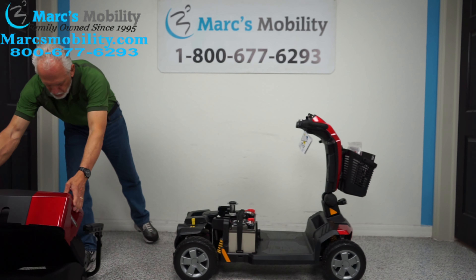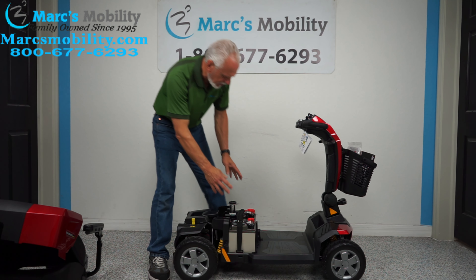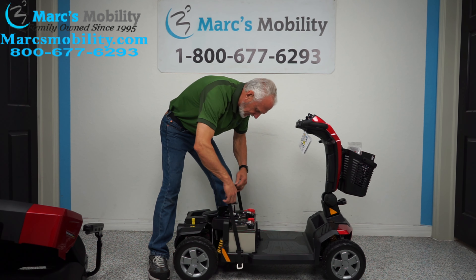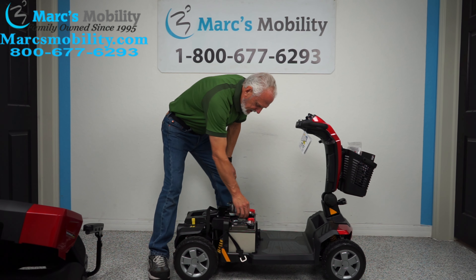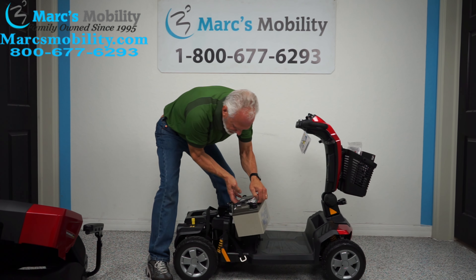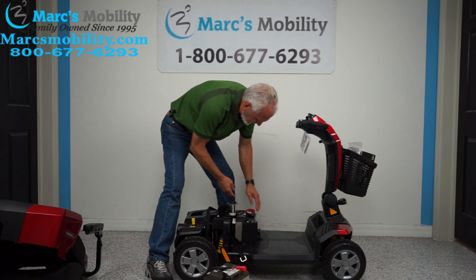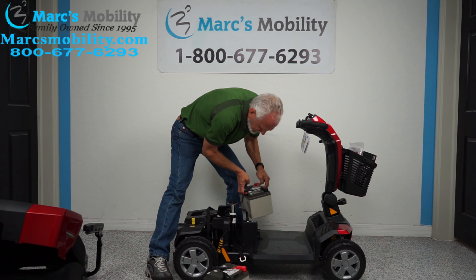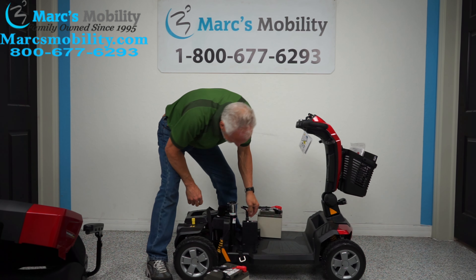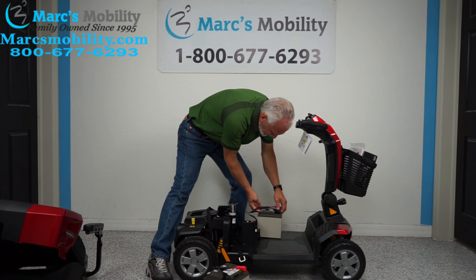These are your two batteries, so you'll take the strap off, put it to the side, disconnect one battery and pull it out, disconnect the other battery — they connect in the middle — just disconnect it and bring it out.